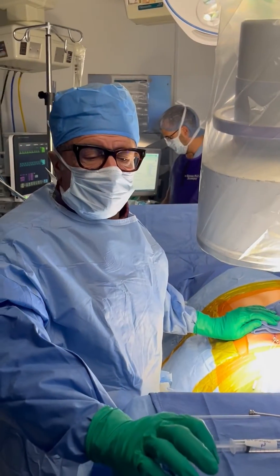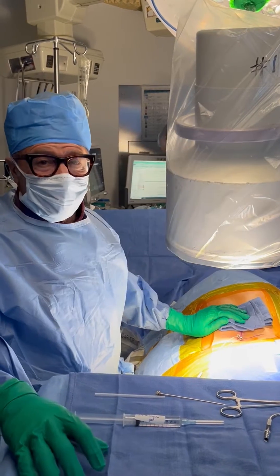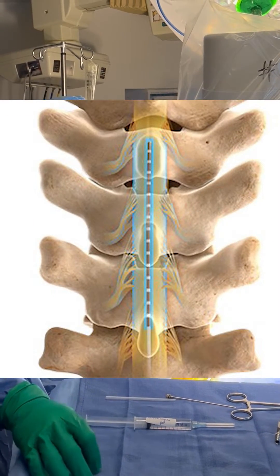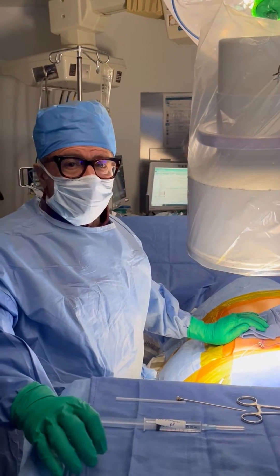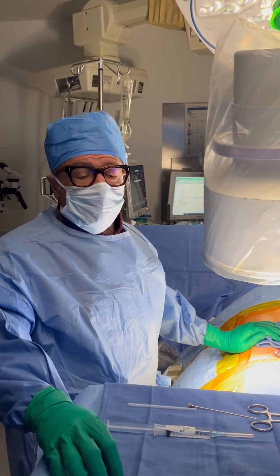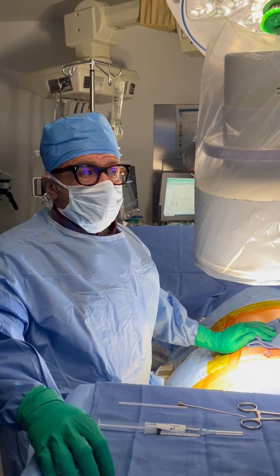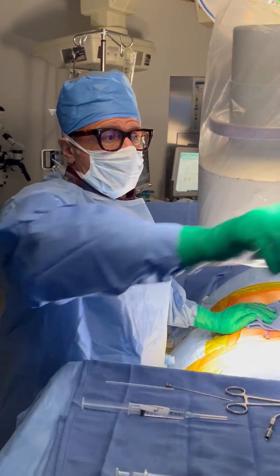It's always nicer if you can have two leads instead of one. These are Boston Scientific Infineon leads — they have 16 contacts per lead. We want to get the optimal pain relief we can for this patient. So if you can get a second trial lead in, it always helps. So we've got our second one in.